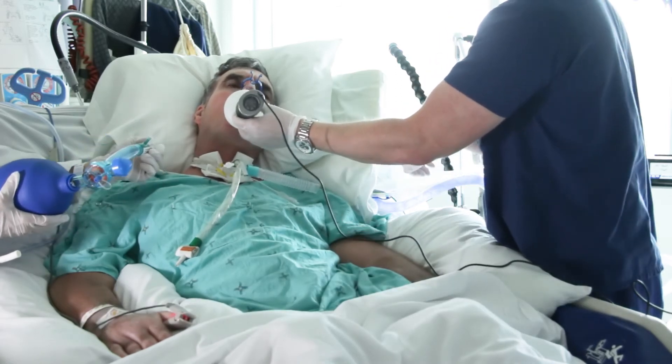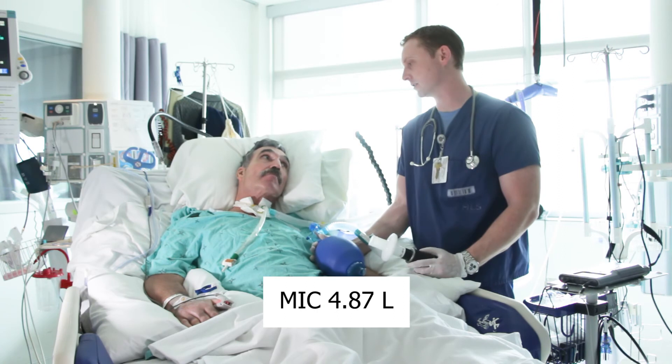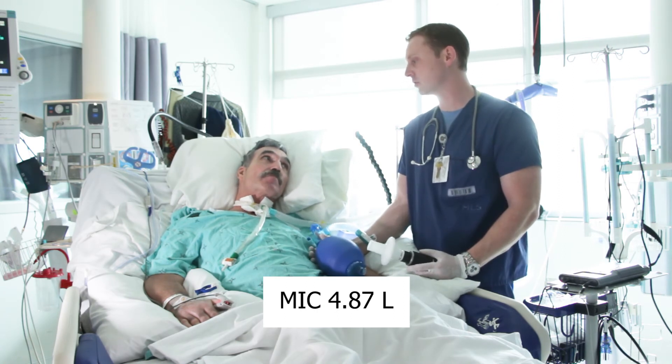Okay, good. I'm going to attach it back to the vent. Greg, your max inspiratory capacity was 4.87 liters. That's all right. Good job. Thank you.